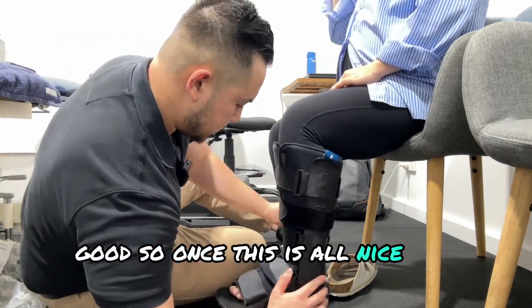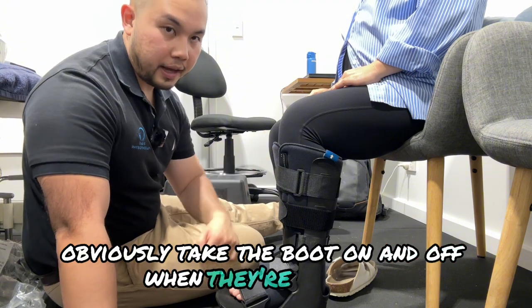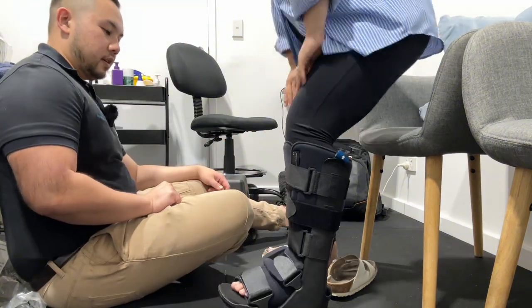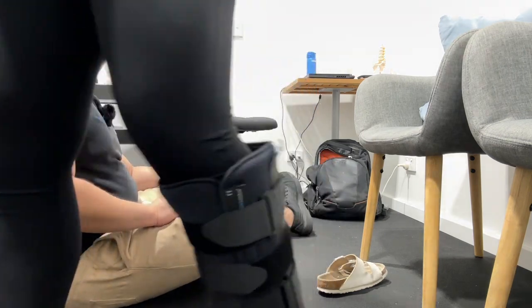Once this is all nice and secure — and I'd be teaching the patient how to do this themselves because they need to obviously take the boot on and off when they're at home — I'd ask them to go for a walk. So get them to stand up and go for a bit of a walk.